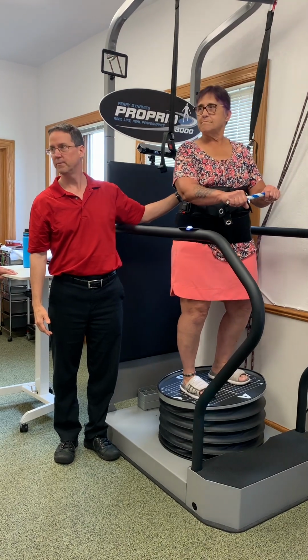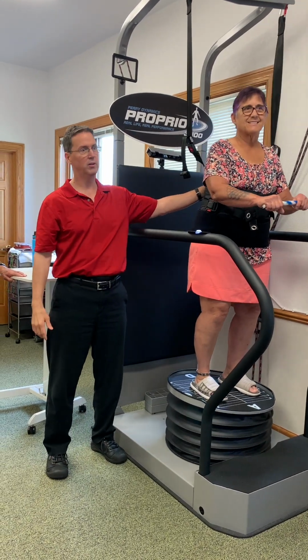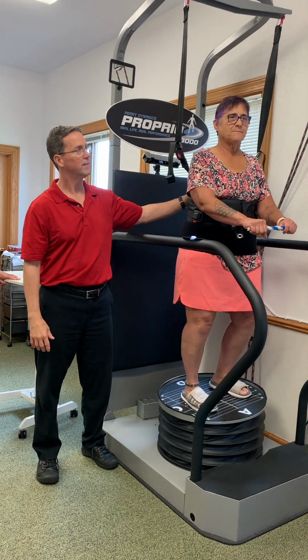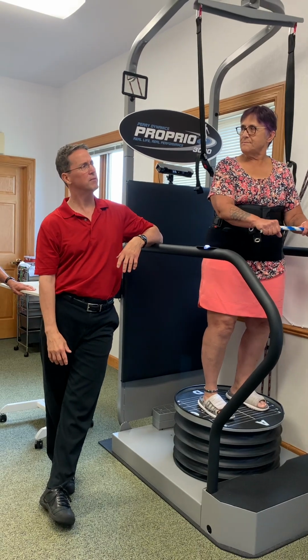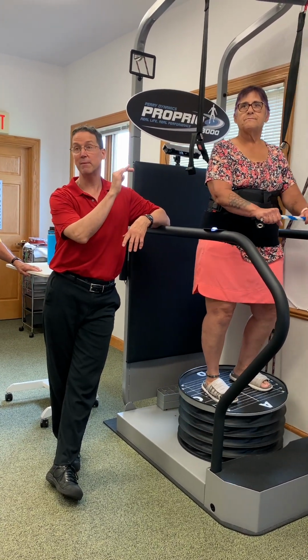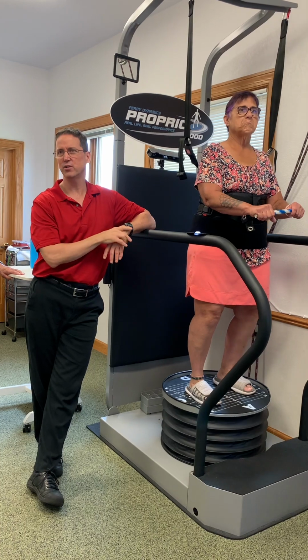Do you feel when you get off of it like you're on a boat? Usually after you're off of this, you get on the ground, and if it's a decent session, like, woo! I feel my muscles worked a little bit, and the experience of the world is a little bit different. So what's the total time you'd be on that? Setup and coming off of this probably takes as long as the time that you're on. To run the couple of formal examinations that we have on here probably takes 7 minutes, and probably each only about 2 minutes each.